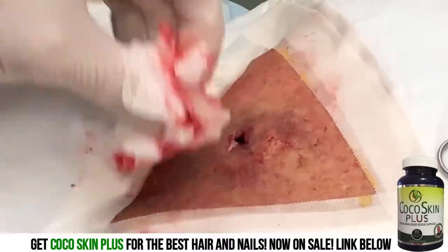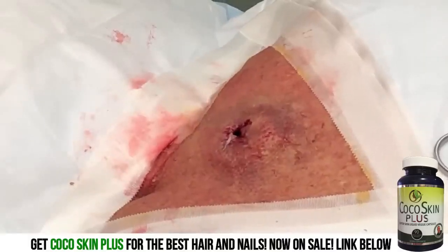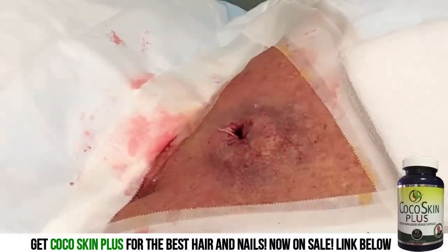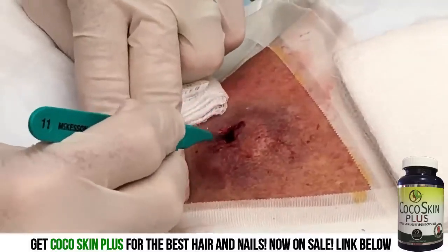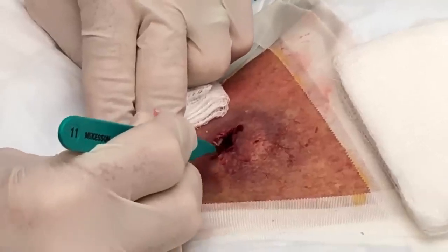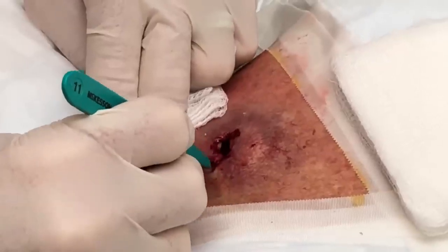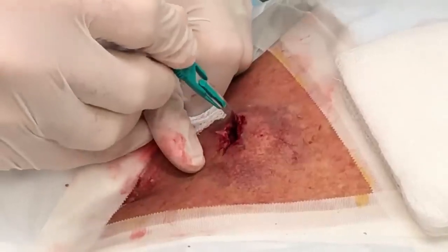Let me go ahead and let's get a scalpel. Okay. Well, it looks a lot better already, I'll tell you that. Yeah. I'm going to open this up just a little bit more right here. Skin is very thick right there. And then right there.